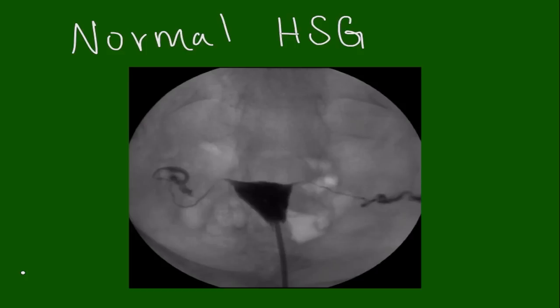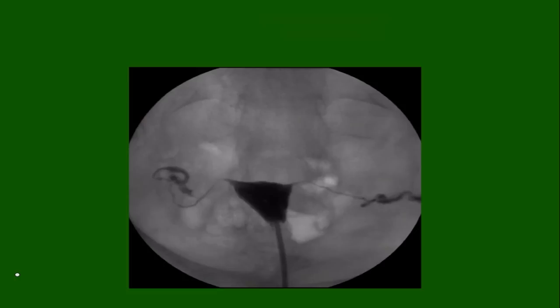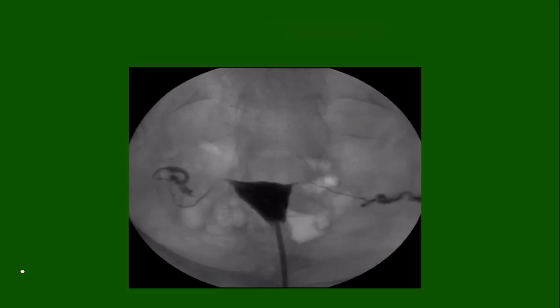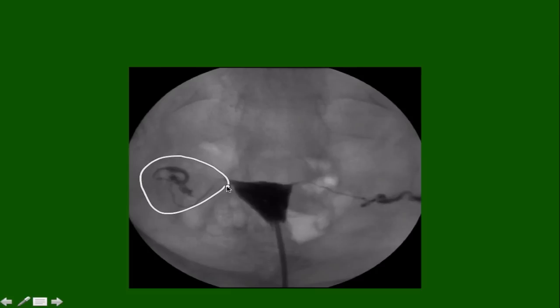The first thing we see is the catheter in the lower uterine segment. Next, we see the uterus — this is a uterus that has normal shape and contour. Finally, we're going to look at the fallopian tube. Fallopian tubes have three parts: the skinny isthmic portion, which is closest to the uterus; the ampulla, where the tube gets a little wider in diameter; and the very end, the fimbria, which is a little difficult to see on these films.